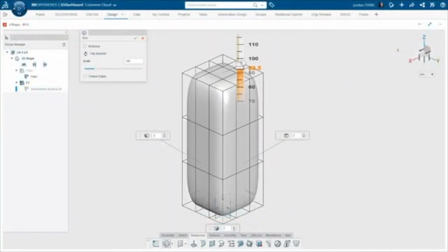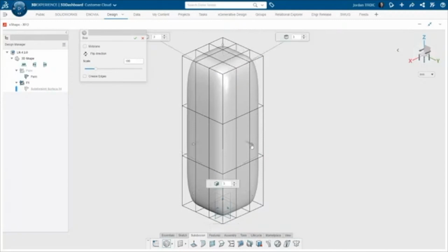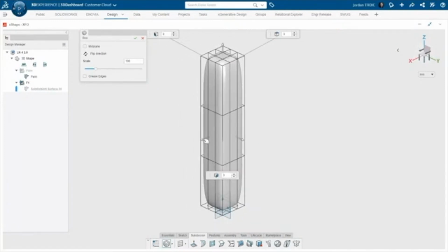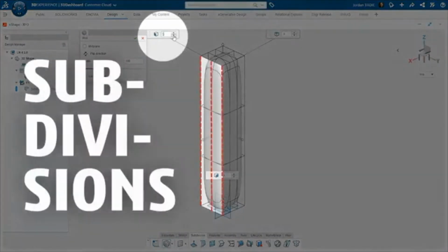And then the next thing that we're doing is we're just scaling to the approximate size. So we're going to be creating the finger here. That's what we're getting started with. And we needed to figure out what the average size was. So we're going 100 by 20 by 20 right now.